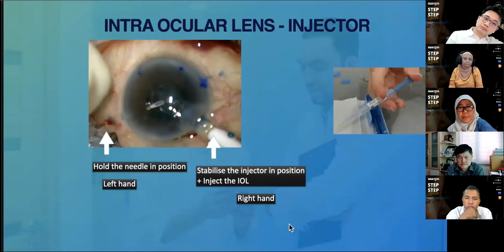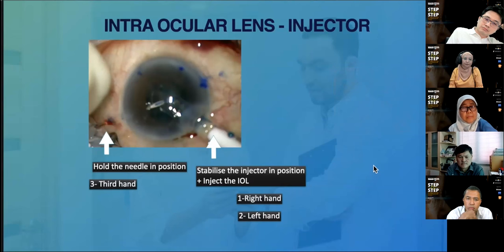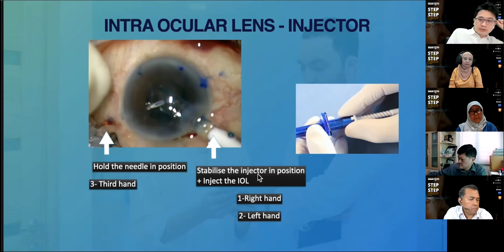So why does the injector seem to be important? We analyzed most videos on YouTube. If you want to insert the haptic directly into the needle, which I call the one-step technique, we need to do the injection of the IOL with one hand and hold the needle in position with the other hand. It sounds like you're only using two hands. This could be true if you are actually using a single hand injector. But what if you have to use a screw type of injector? We will be using both hands to inject the lens, and obviously now we need a third hand to help hold the needle in position.